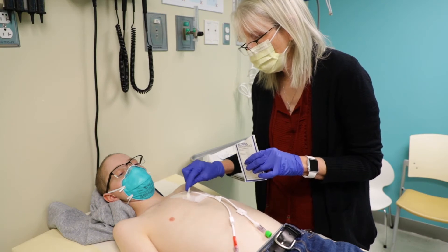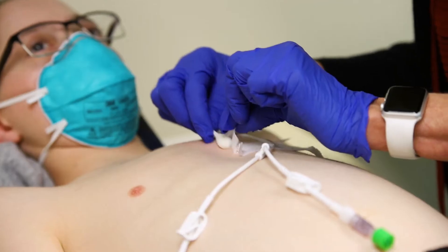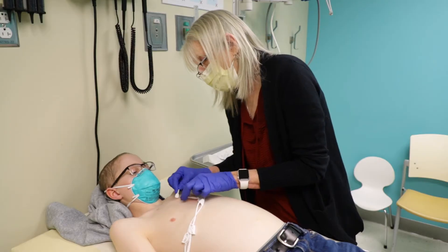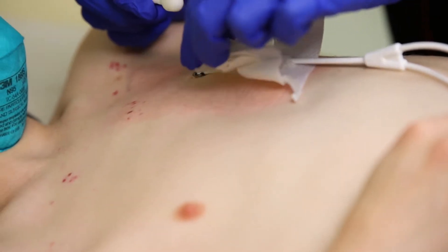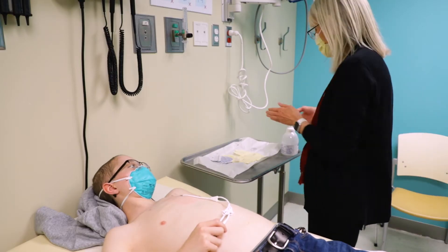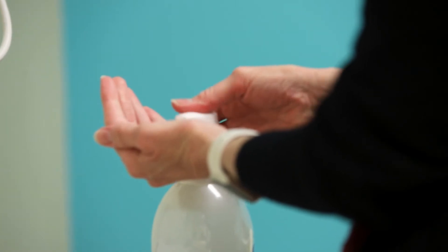Take off the old dressing. Try to remove the border of the dressing first before removing the part which is on the central line. After you remove the dressing, wash your hands for 15 seconds.